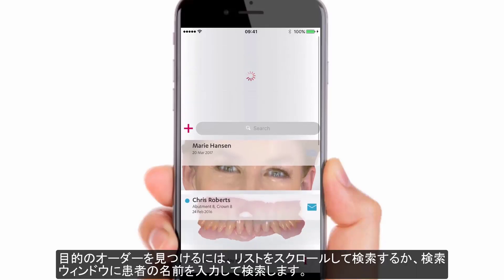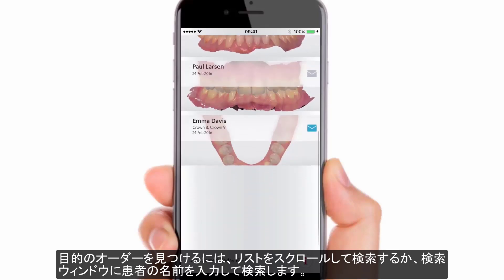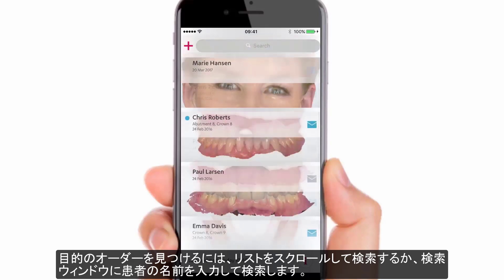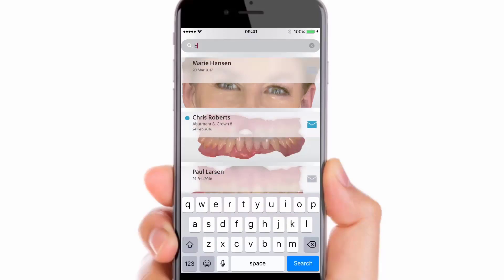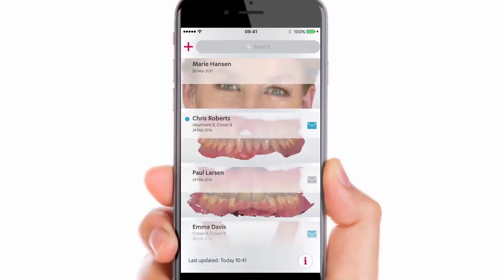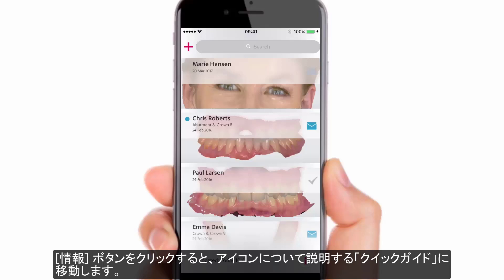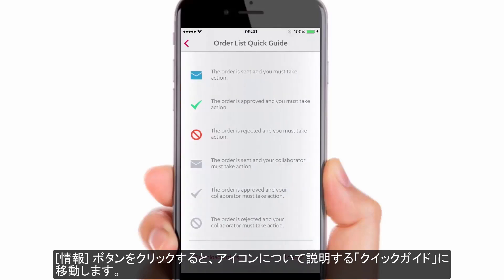Scroll through the case list to find a desired case, or type in the name of the patient in the search window. All cases visible on the list have their status marked by a suitable icon. The information button, once clicked, will lead you to the order list quick guide where the icons are explained.